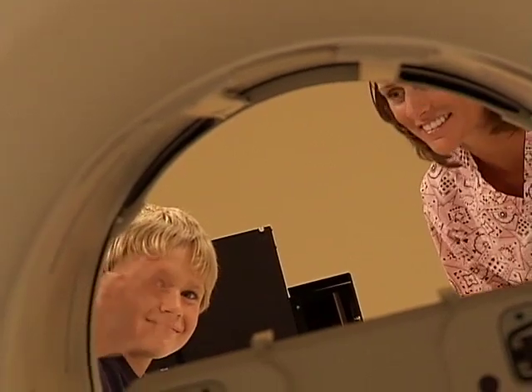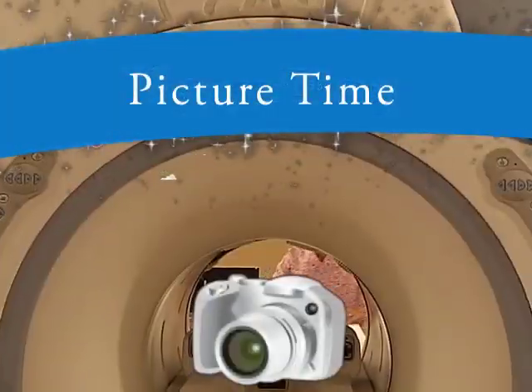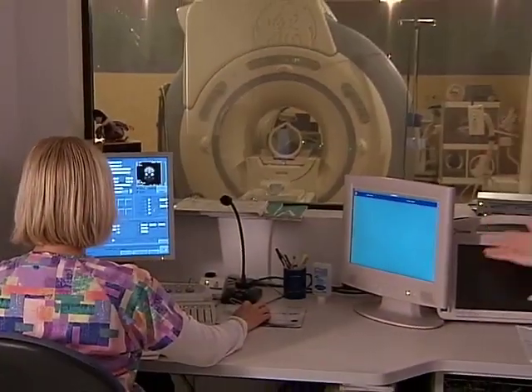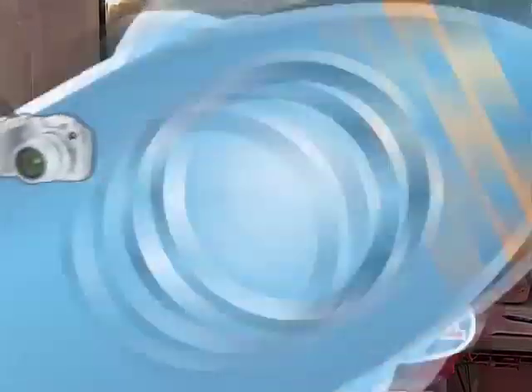Here's the tunnel you'll be traveling through — you can see straight through to the other side. Inside the tunnel is where the pictures are taken. Through this window is where the MRI technologist works. She's the person who takes the pictures. Imagine you're an astronaut and this is mission control — from here, the technologist controls the giant camera.